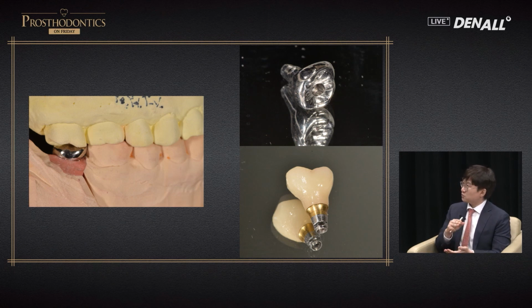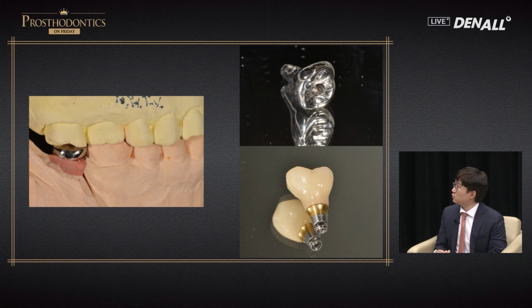If the implant is placed too shallow and the space to the opposing tooth is just 4 millimeters, when I mill the custom abutment, the tooth shape can also be milled. Connection part material would be the same. So this type of prosthesis is what I use these days.